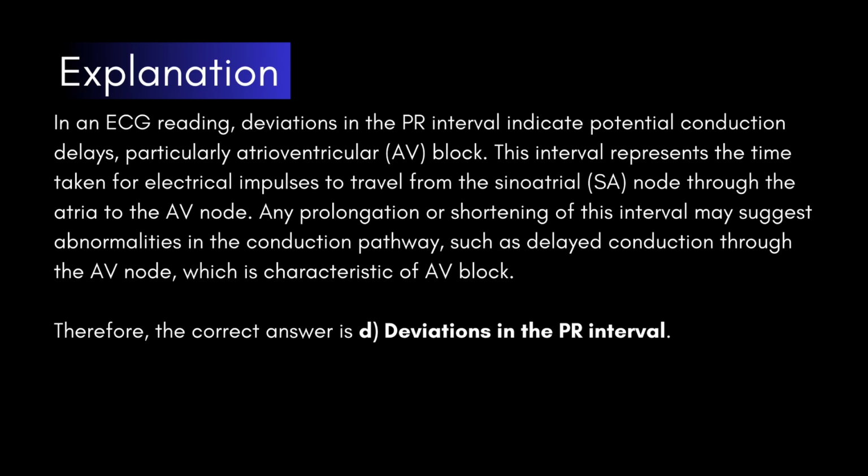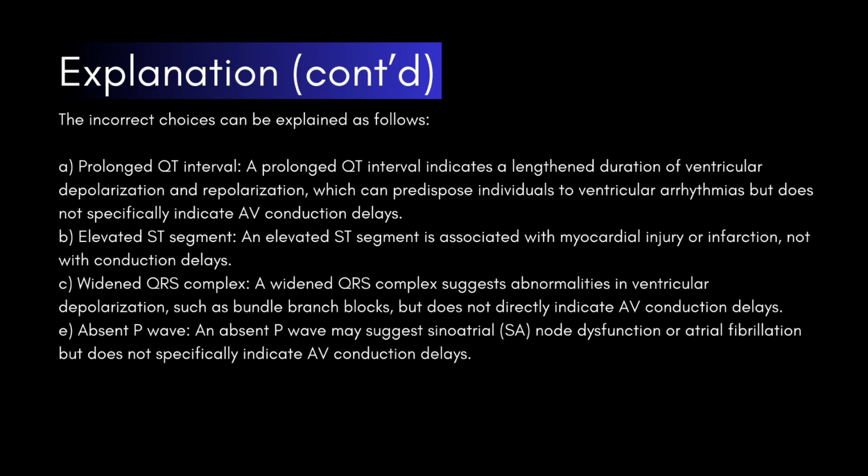Let's go ahead and take a look at why the other answer choices are incorrect. Prolonged QT interval. A prolonged QT interval indicates a lengthened duration of ventricular depolarization and repolarization, which can predispose individuals to ventricular arrhythmias, but does not specifically indicate AV conduction delays.